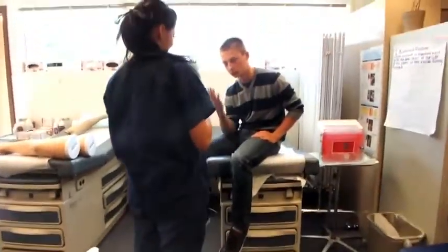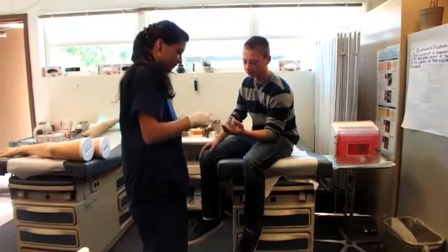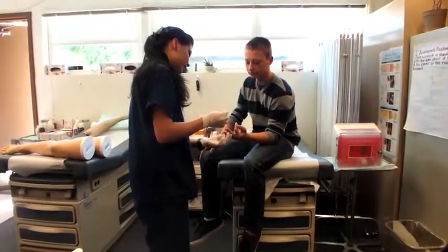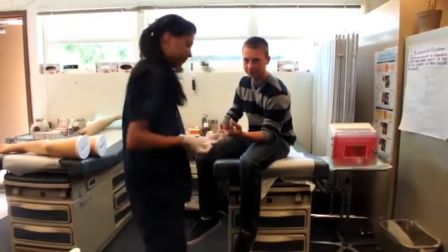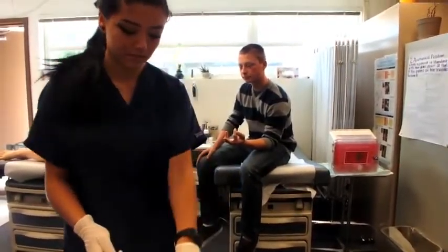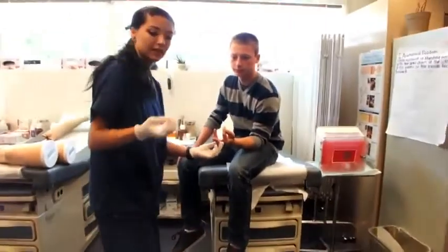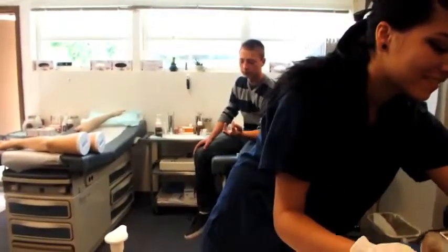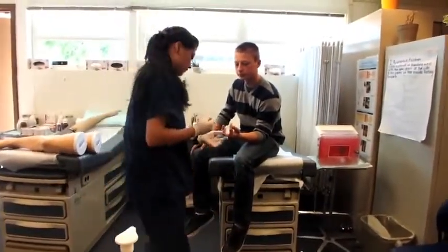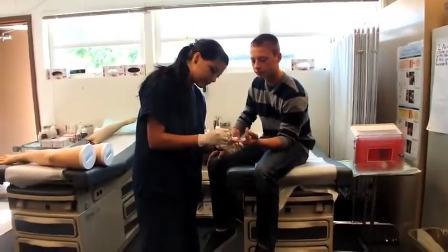Which is your dominant hand? Right. Alright, I'm going to use your left. Okay. Alright, and I'm going to use one of these fingers. Use the non-dominant hand and one of the non-dominant fingers to perform the test. Alright, I'm going to twist this, take it out. Alright. What you're going to do is make sure that it's horizontal across the finger like this. Poke.